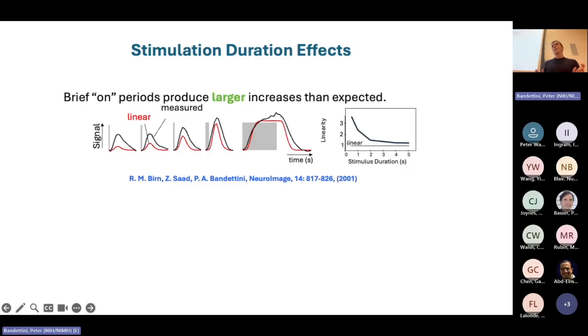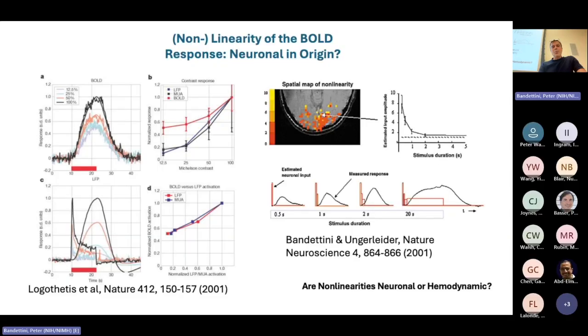It also turns out the system is nonlinear for very weak stimuli. And I don't have this data, but there was some work that showed, with simultaneous EEG or electrodes with attention, they found that for very low levels of attention, it turns out that the BOLD response overrepresented the level of activity that was represented by low level activity with attention studies.